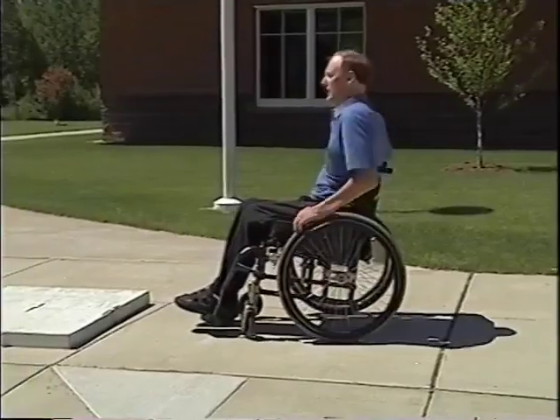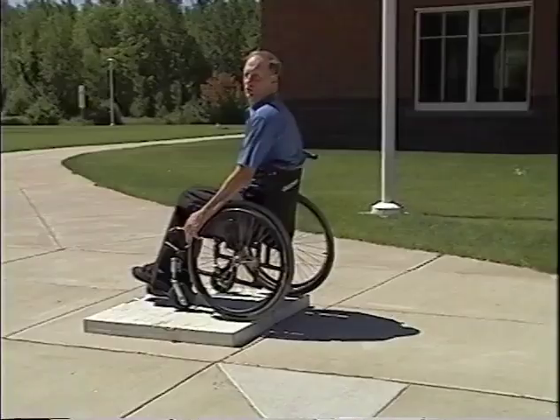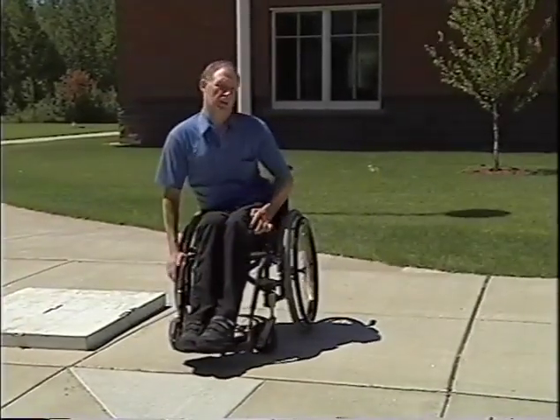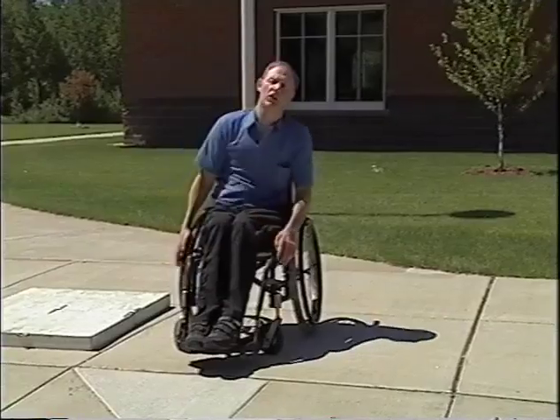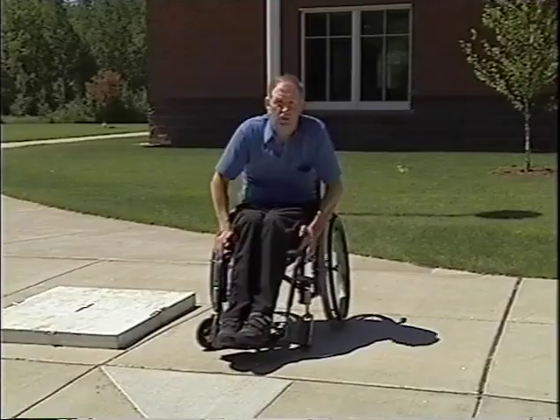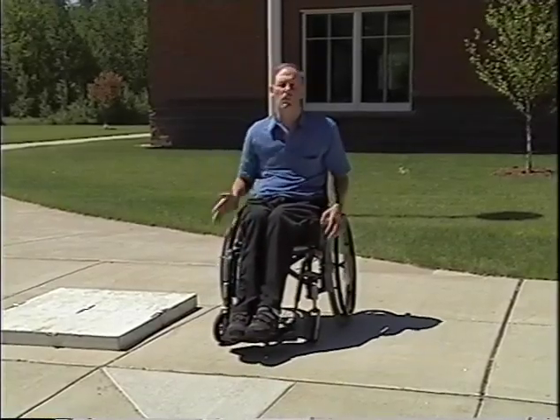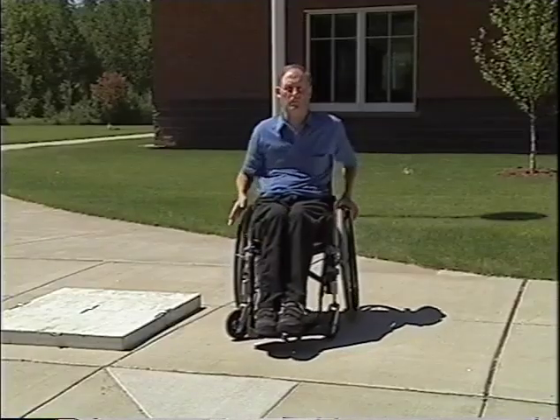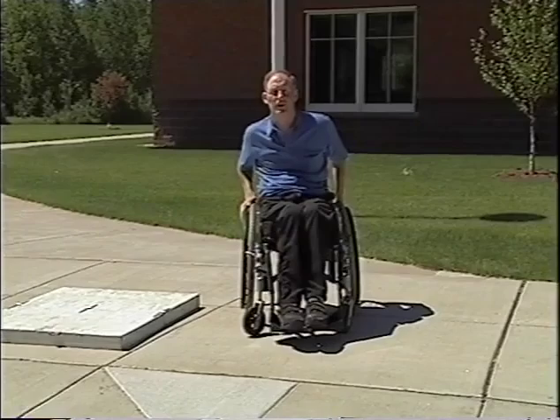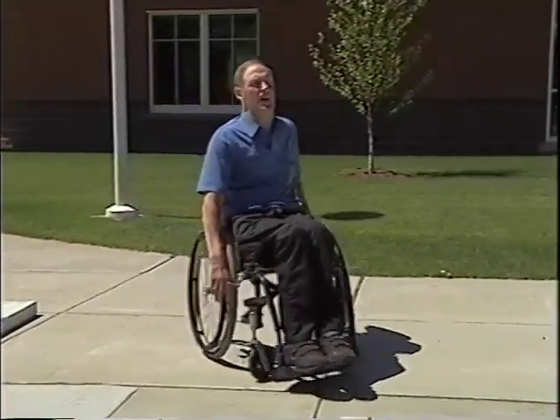All right? If you need to stop, if you're coming off and you do need to stop, just stop one wheel and let the chair turn around. If you stop both wheels while you're in a wheelie, you're most likely to fall over backwards. So just stop one wheel at a time if you do have to stop. But otherwise, just let the chair roll off backwards and you'll be fine, keeping your weight to the forward end of the chair.